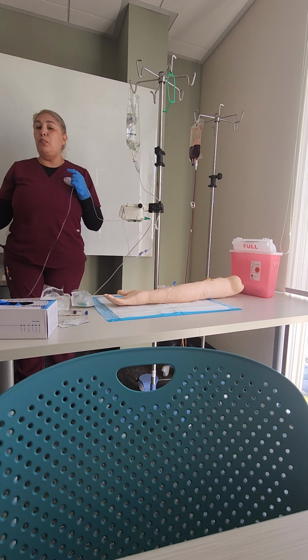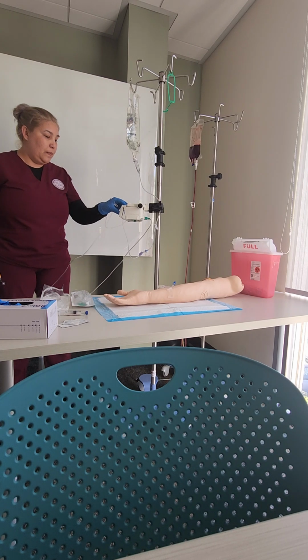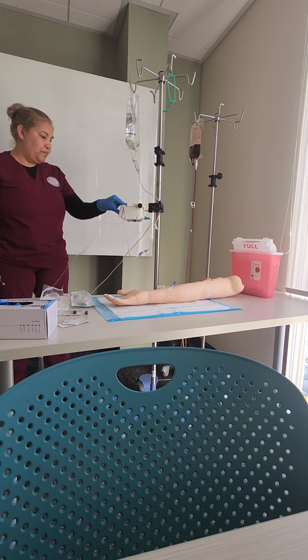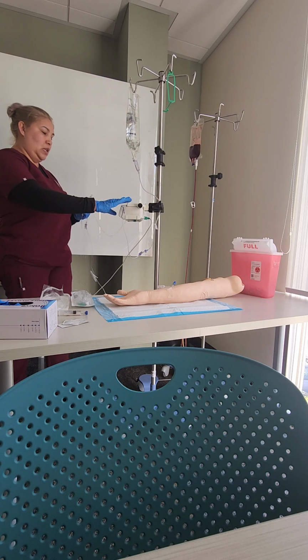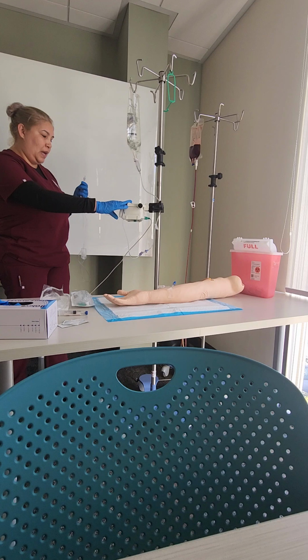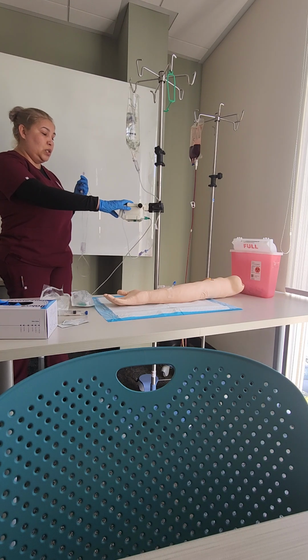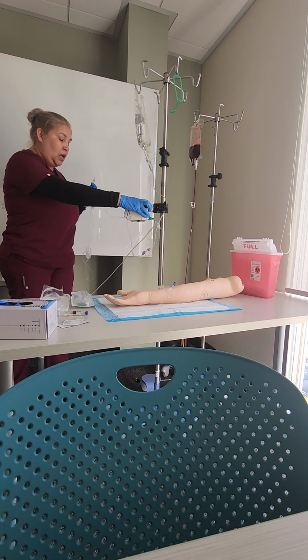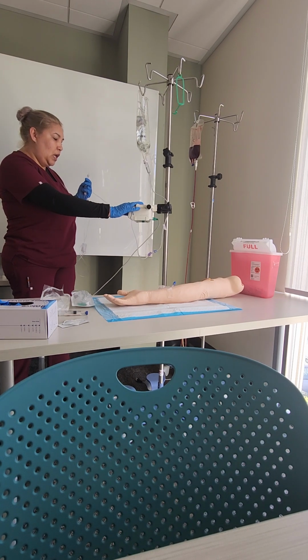Okay, priming is done. Now I want to program my pump. So it's asking me for a primary. Yes, I want to prime my primary, and I'm going to set the rate at 75.